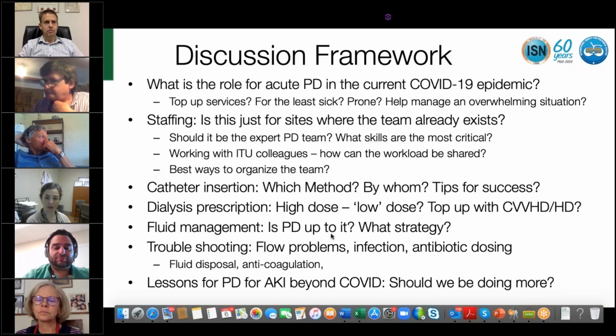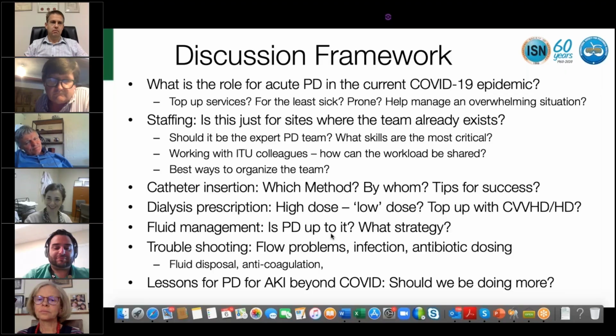And actually, I saw on one of Edwina's slides, Dr. Jacob Cinnamon was the head of our interventional radiology department, and he's the one that took it upon himself to do this. We were successful with all of the catheter placements, and there were no issues with the placements themselves, but we had some infections later on in the course that I can get into if you would like. I'll stop there.